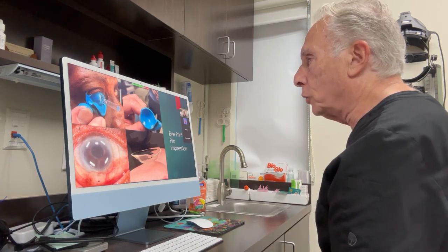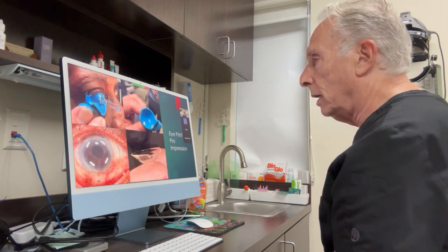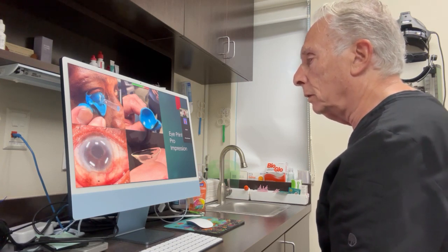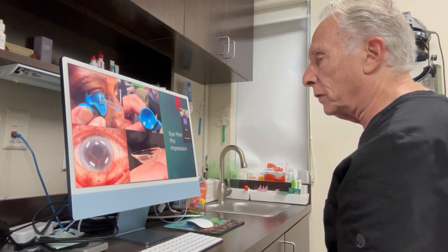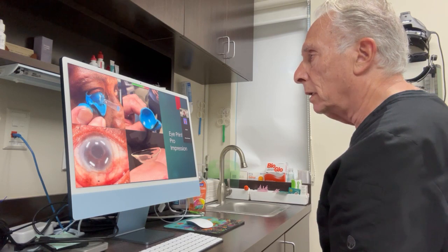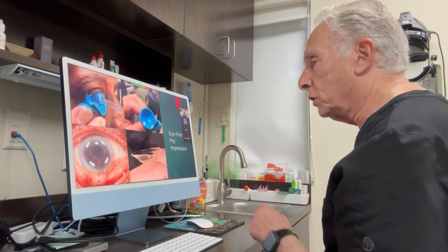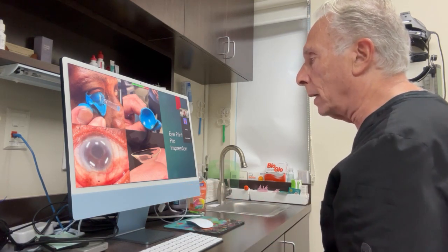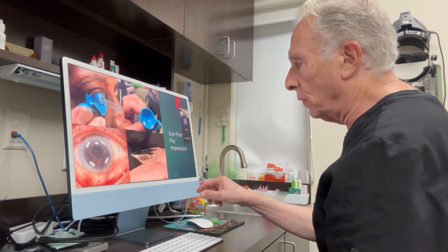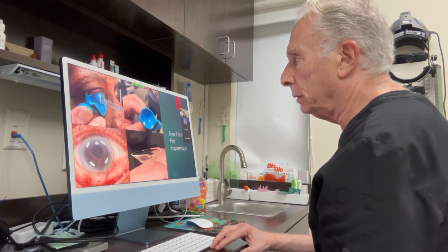Another technology that I really enjoy working with is called eye print or impression technology. This particular patient has a glaucoma shunt going from 6 o'clock toward the pupil. You can see on the bottom left an image of that glaucoma shunt. And we took an impression of this eye, and we had an iPrint Pro scleral lens made where that shunt was taken into consideration. You can see on the bottom right the outline of the iPrint Pro scleral lens that's designed to vault over that shunt. And the patient was quite comfortable with this particular design.